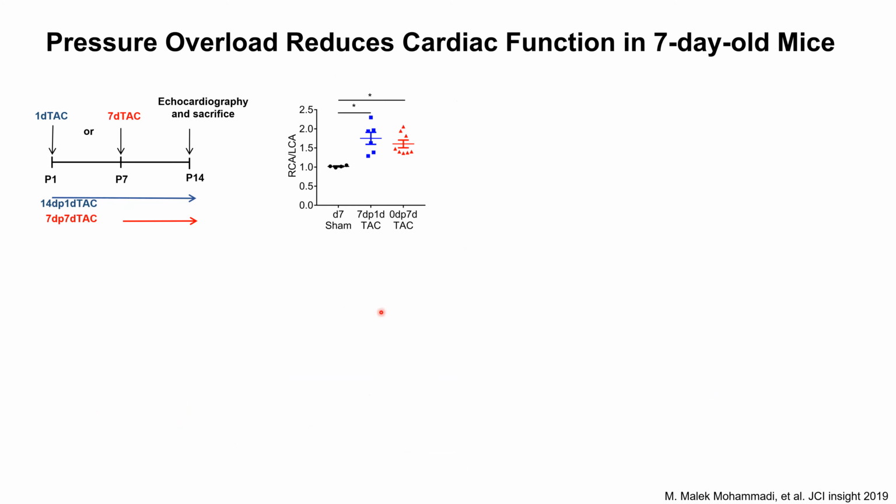As you can see, flow velocity revealed a similar degree of left ventricular pressure overload 7 days after induction of pressure overload in day 1 mice, as you can see here, and immediately after surgery in day 7 mice. And also at the end of the study, both groups were exposed to the same degree of pressure overload. So it means that from day 7 to day 14, they were exposed to a similar degree of pressure overload.